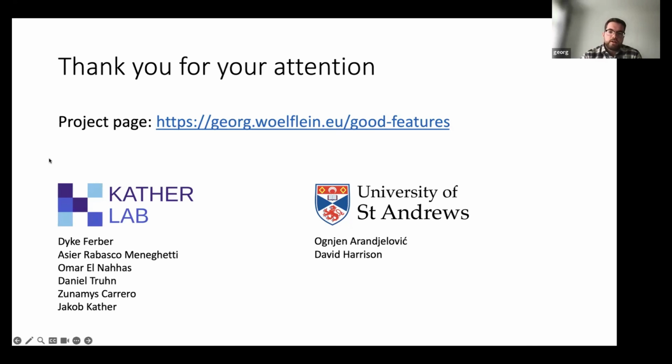So are you asking why this decreases the accuracy of the feature extractors, the black edges? Yeah. But I can't answer that, unfortunately. I don't know. I think it's probably because the SSL feature extractors never saw these sorts of black edges during their training, so they don't know how to handle that. Because usually, of course, you have these augmentations where you rotate the image, but then afterwards you always perform some sort of center crop so that there are no black areas. At least that's how I understand.